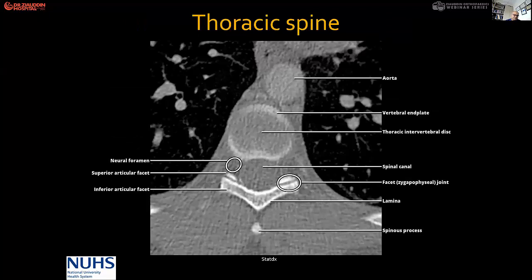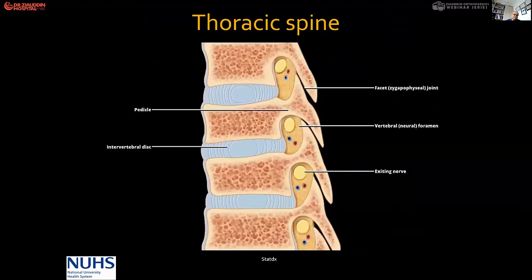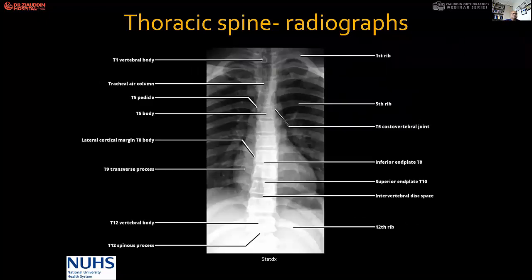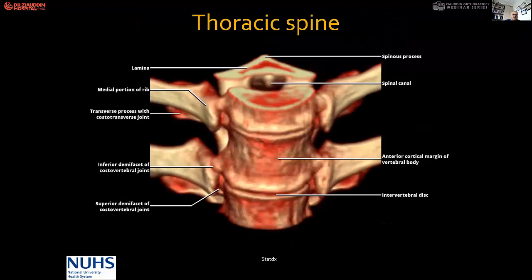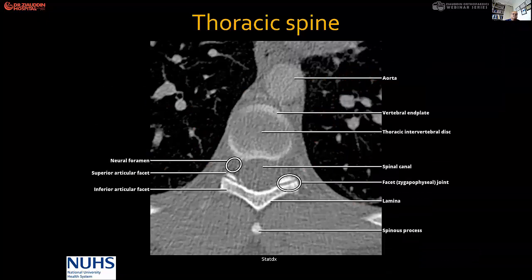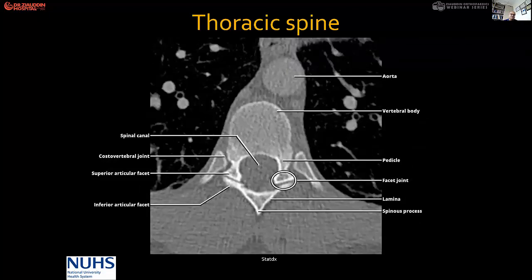The relationship of the nerve root close to the pedicle in the thoracic spine is the reverse of what I showed you in the cervical spine. On an AP radiograph important things to see are the tracheal air column, superior end plates, vertebral bodies, pedicles, and costal-transverse elements. On CT reconstruction you can clearly see the lamina, pedicle, and vertebral bodies. The thoracic neural arch is again made by the pedicle, the anterior part of the vertebral body, and the lamina.